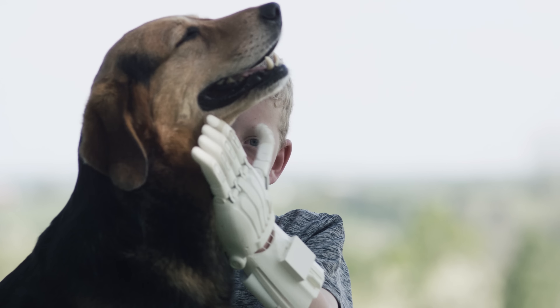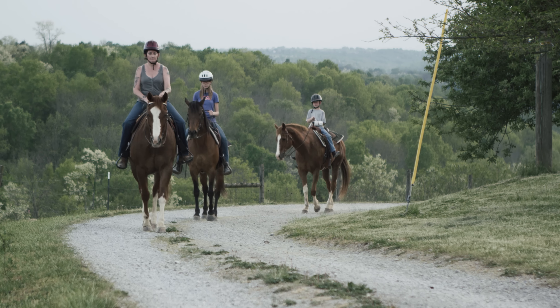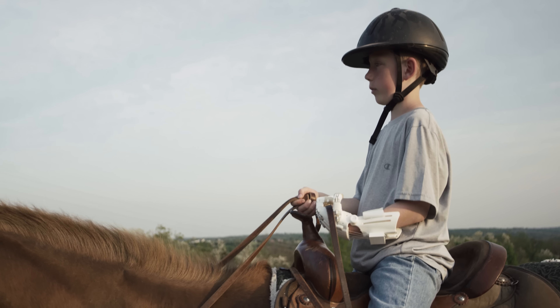It feels good to know that having the printer, having the resources available through the community, being able to print this out — I made this for him. And it does feel really good.